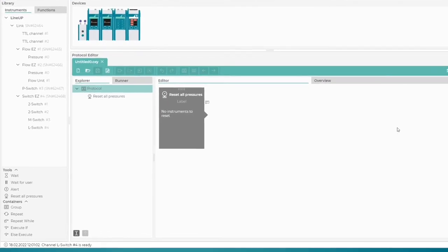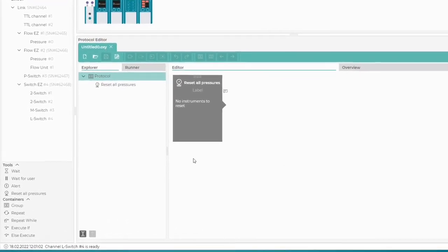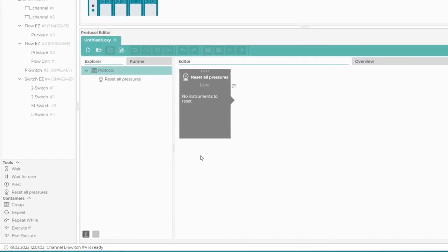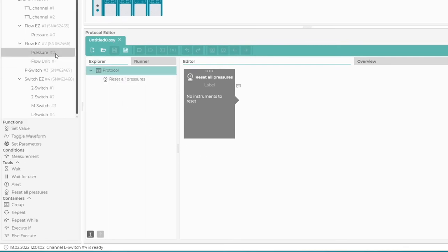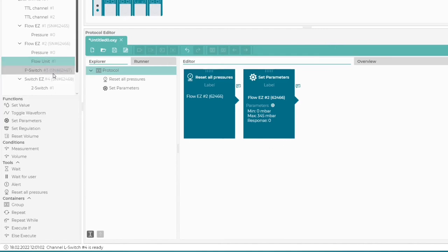We leave the block Reset All Pressures. Although we will work with flow rate, we add the Set Parameters block for FlowEasy at the beginning. This way the pressure is displayed in the Overview tab and is also recorded.